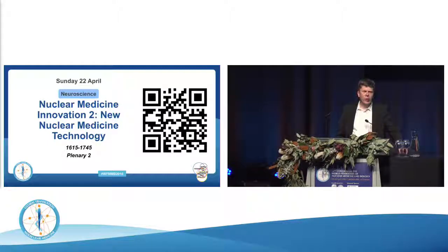I mean, a lot of people are doing list mode reconstruction anyway now, so that trend was already happening, but this just makes doing sinograms almost obsolete, except for perhaps rebinning events into sinograms just for quick QC reasons, just to get a quick check of the data.